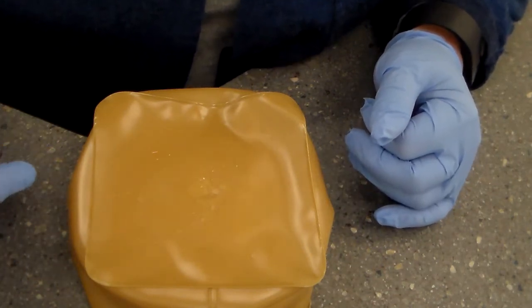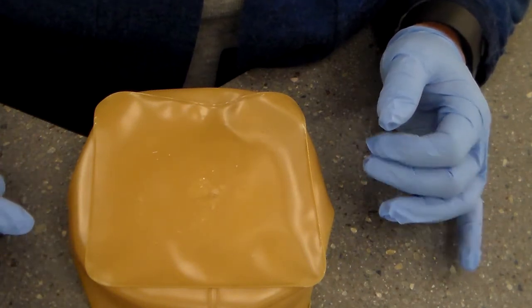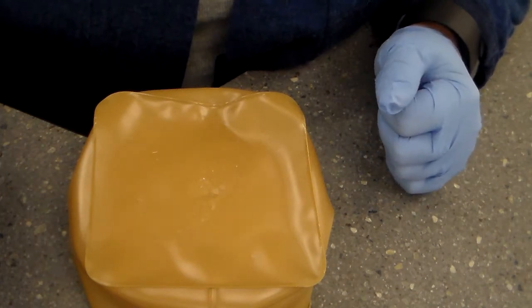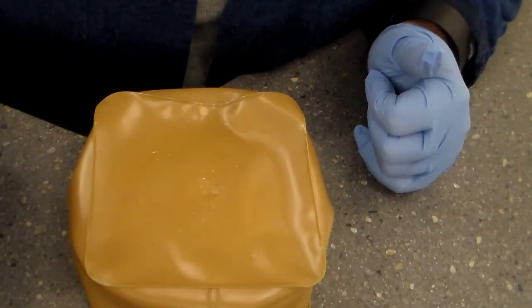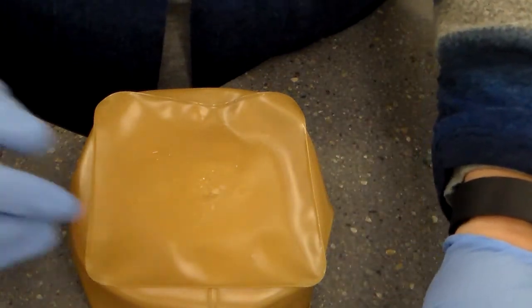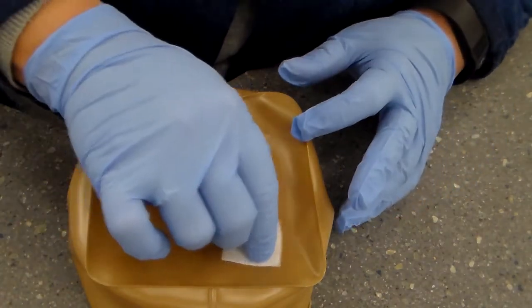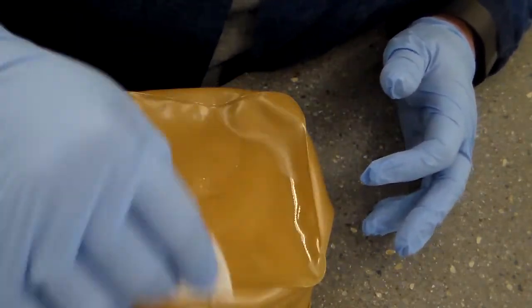If you don't remember where intramuscular sites are, go back to the PowerPoint that I've presented to you and look at the appropriate sites for an IM injection. You can also look in your skills book that you bought. Then we're going to clean the site, just like we did before. We're going to start in the middle and move out in a circular motion. So that's how we clean our site.